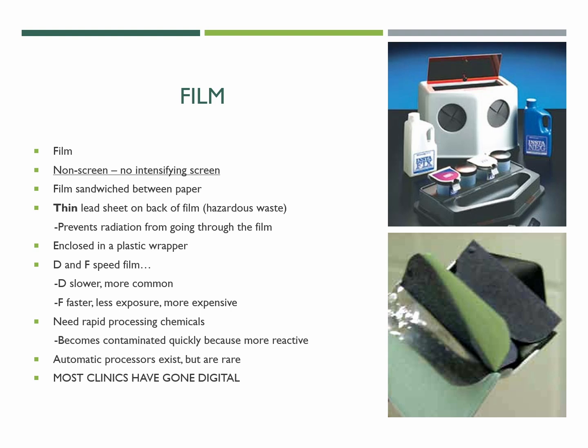You can see here above, that's what we call a chairside dental machine. You can actually be out in the light because you put your arms through those little black cross-hatched inserts, and you're going to dip along as you go to develop your film. So you're going to get a chance to do that at the beginning of the semester.